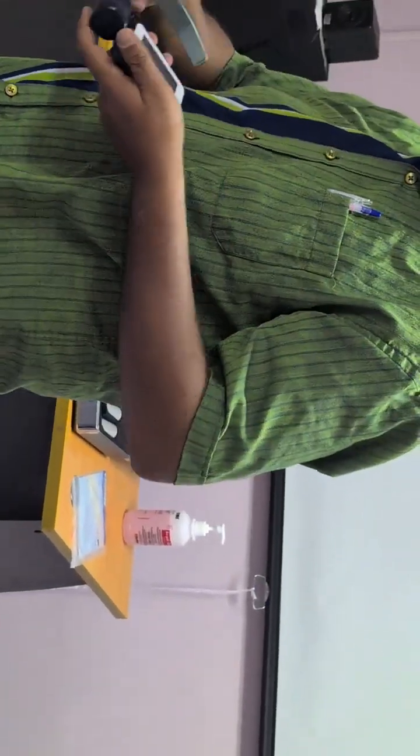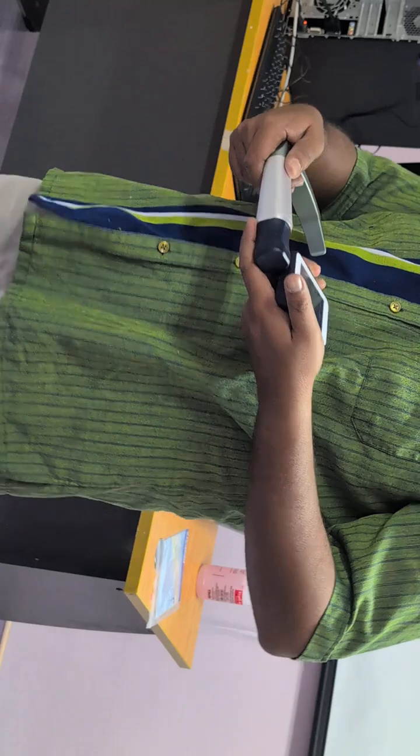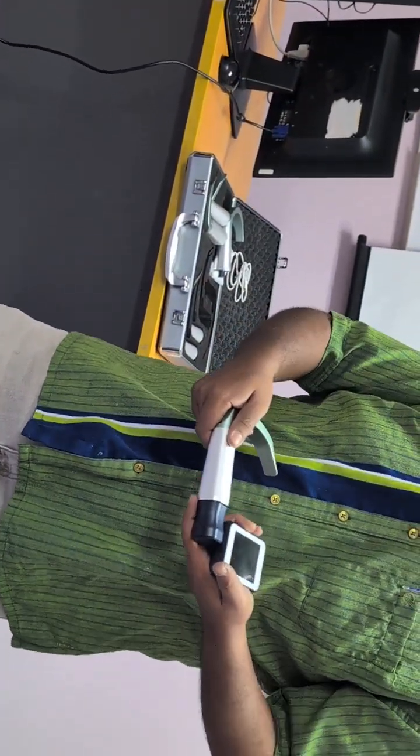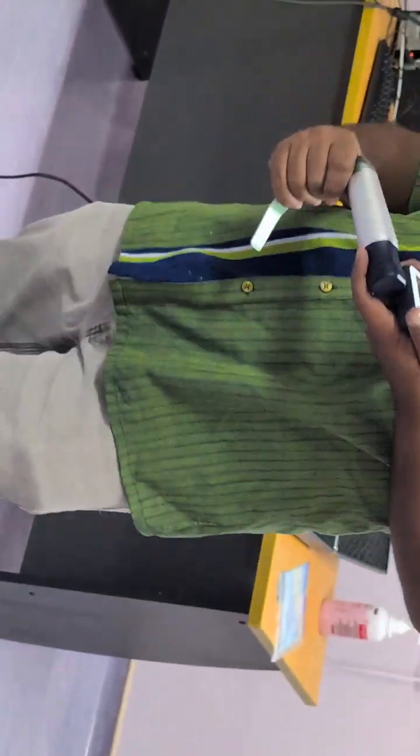Cara pasang is body to body. When I say body to body, this to this. Okay? And many people ask me, do you want me to go down or up? If you go upwards, the patient is going to see the monitor. If you go downwards, you're going to see the monitor. That's only the difference. Okay?